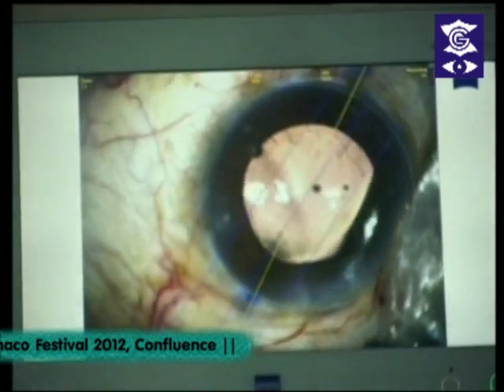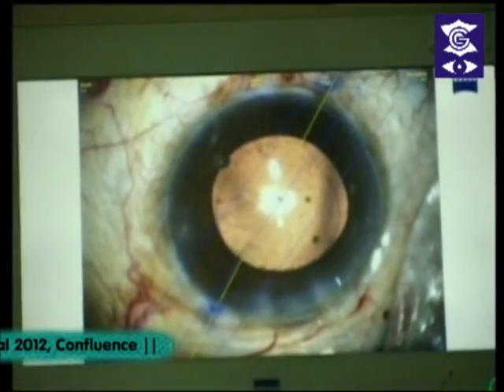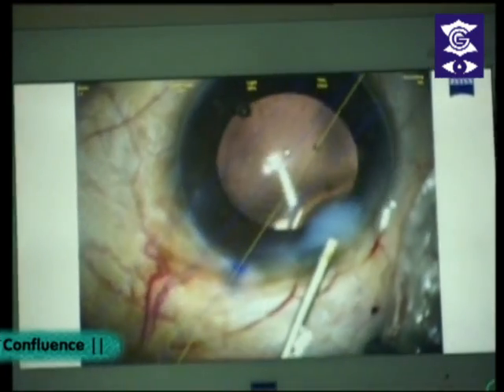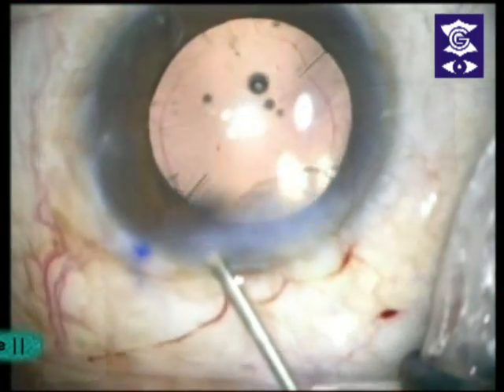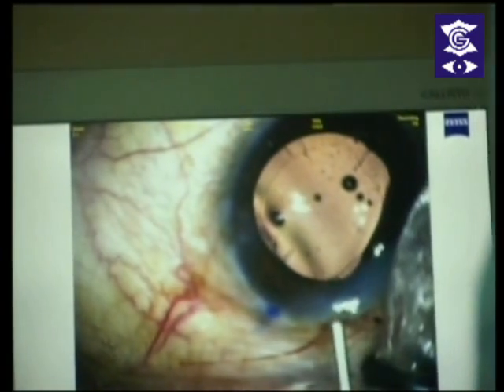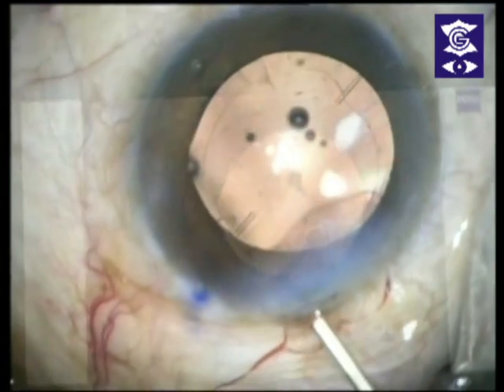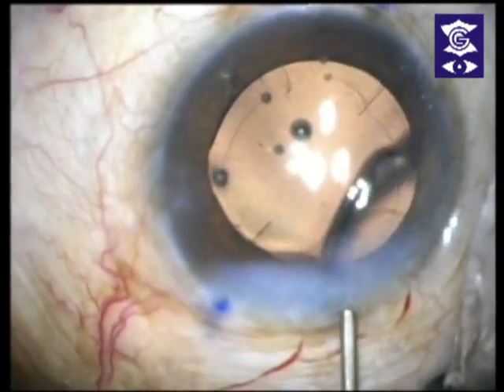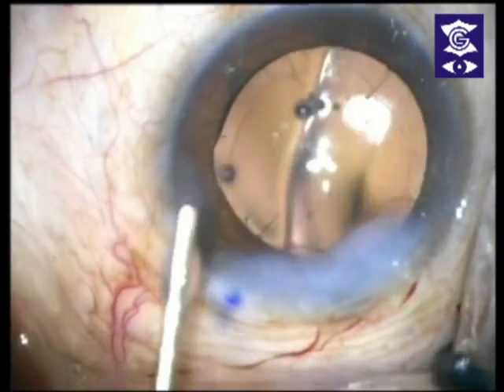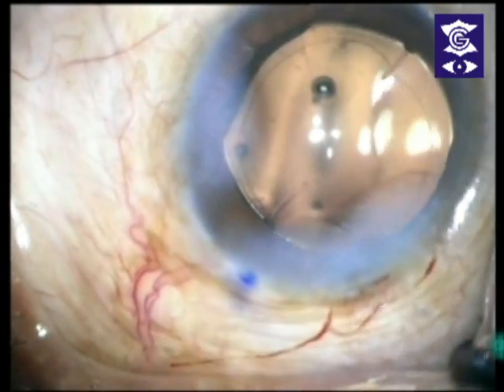There's no need to realign. We'll hydrate the wound and we are through. You can see the blue mark perfectly aligning with the lens axis. The wound is hydrated well — it's a small wound. The chamber is well formed and the axis of the lens coincides perfectly.